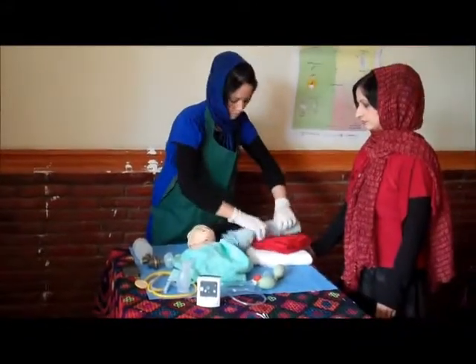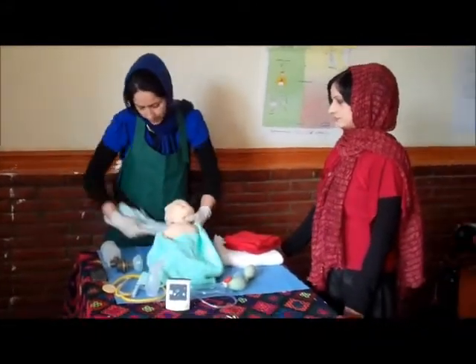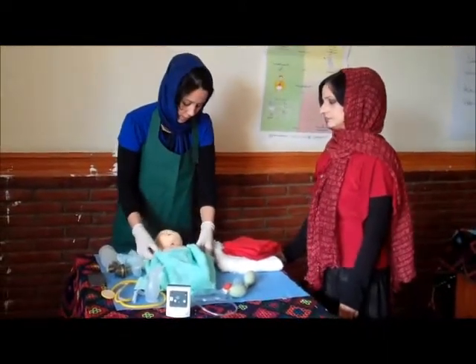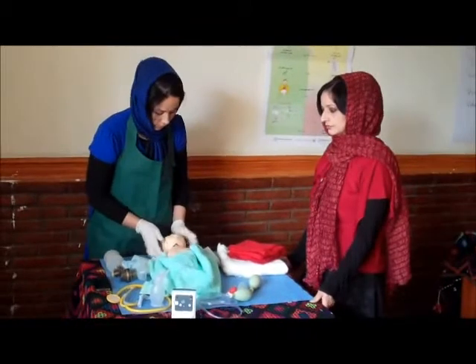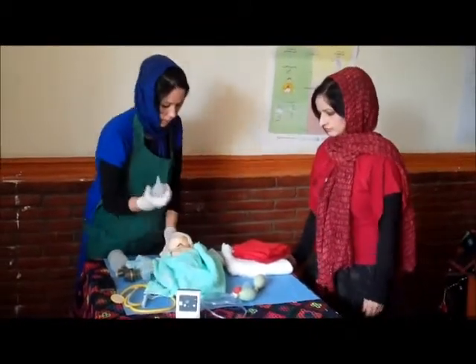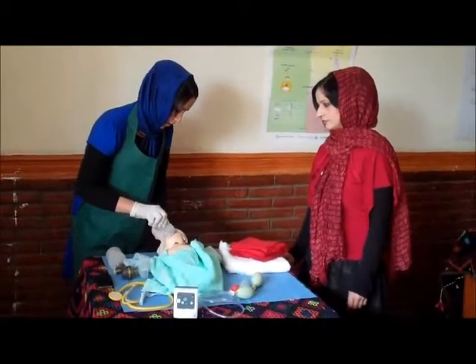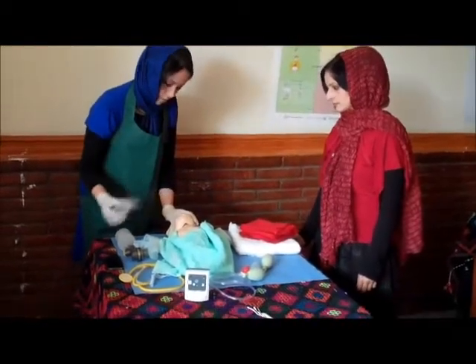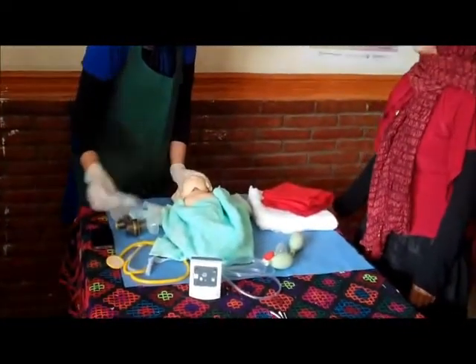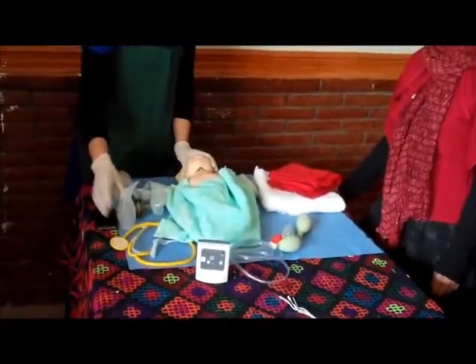First, we should fix the head. We put a cloth or roll under the shoulders and fix the head in the sniffing position. Then we apply suction — five centimeters into the mouth and three centimeters into the nose.